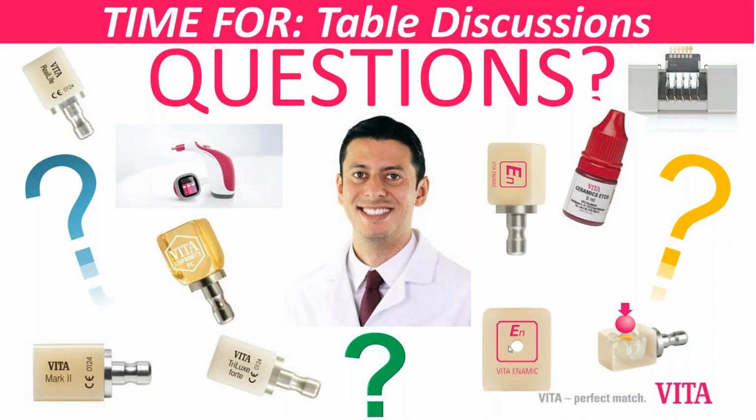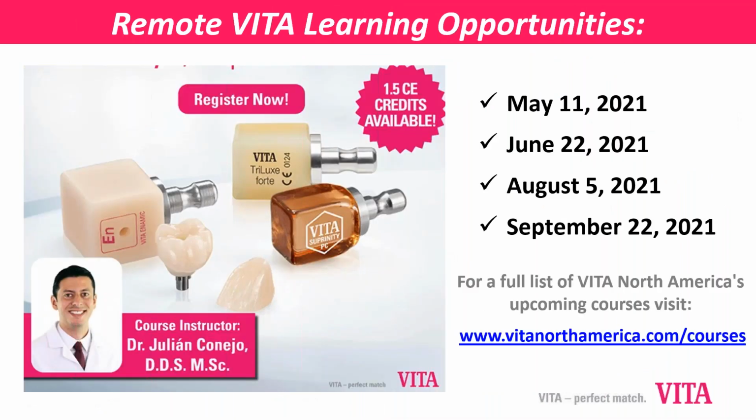But if you're doing one veneer on a number 10, even if you use a multi-chromatic block, for example, you might need to customize a little bit more that incisor edge and those mamelons. So that's where we need to stain and glaze.